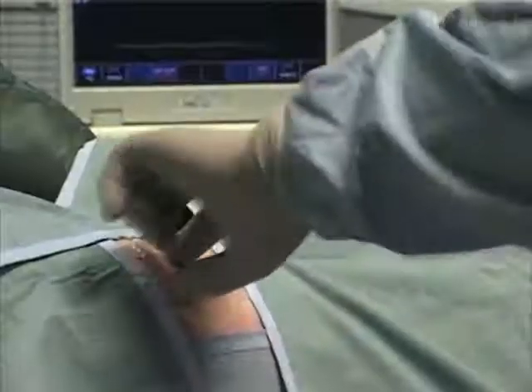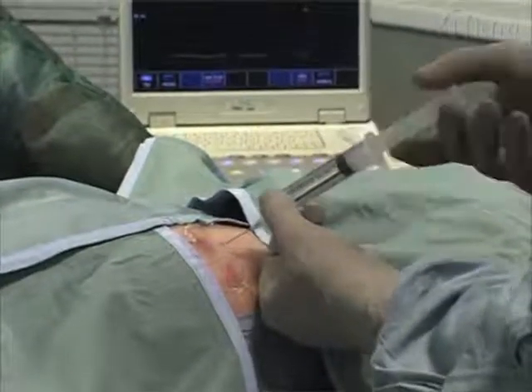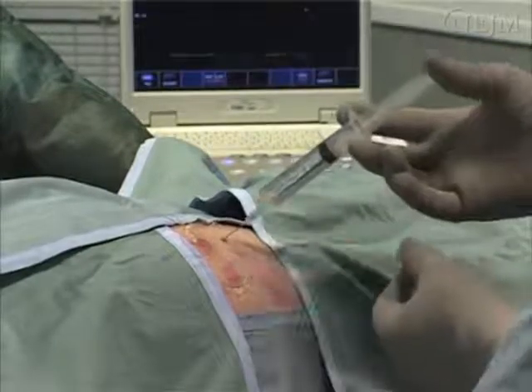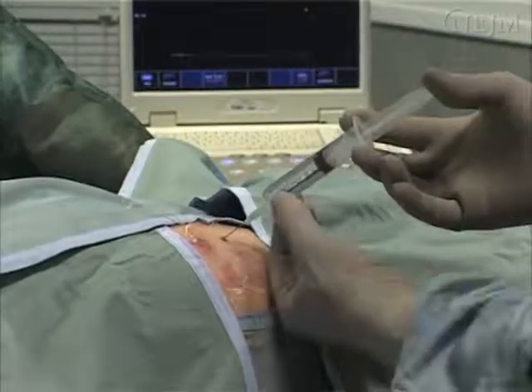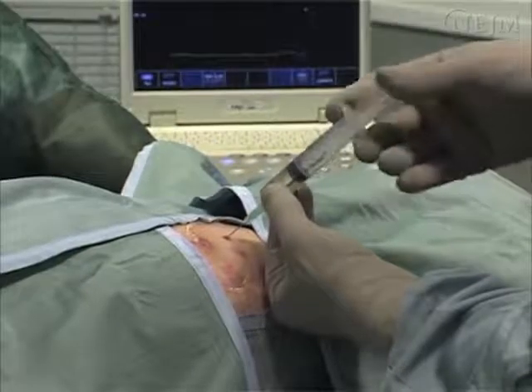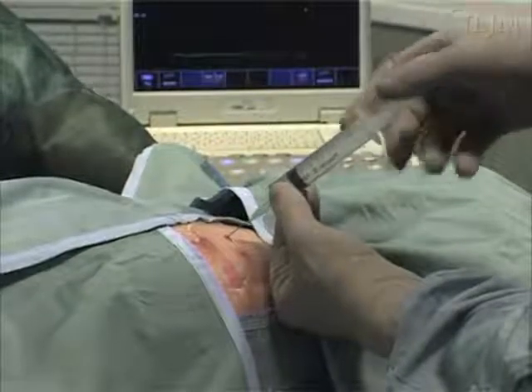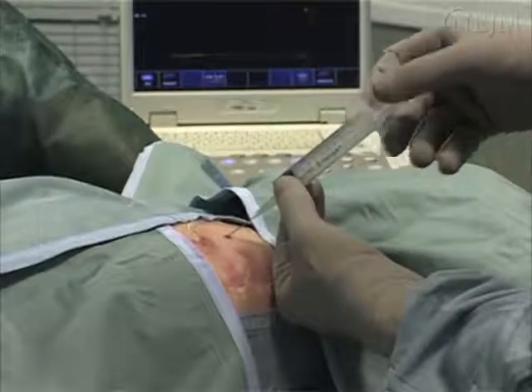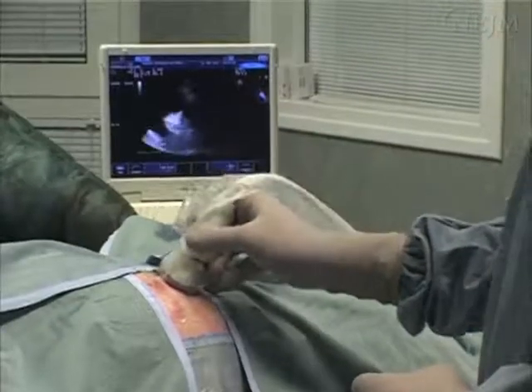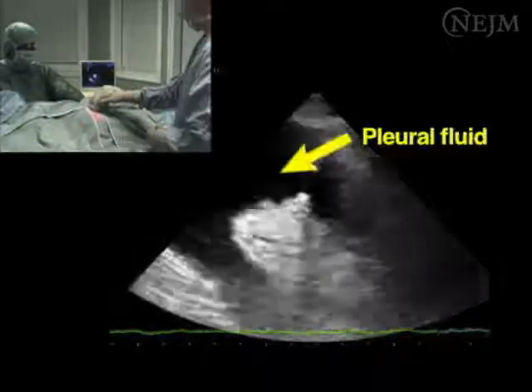Using a 10 milliliter syringe with lidocaine, create an intradermal wheal where the skin has been marked. Anesthetize the superficial tissue and then the deep tissues. Gently aspirate at frequent intervals, checking for blood, to prevent any inadvertent intravascular injection of anesthetic. Now reconfirm with ultrasound that the pleural effusion is still visible where the catheter is to be inserted.